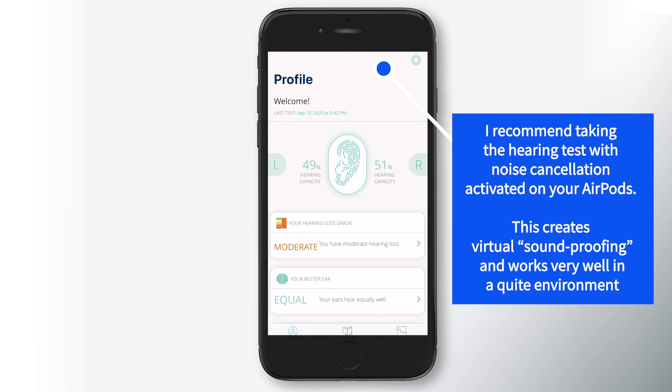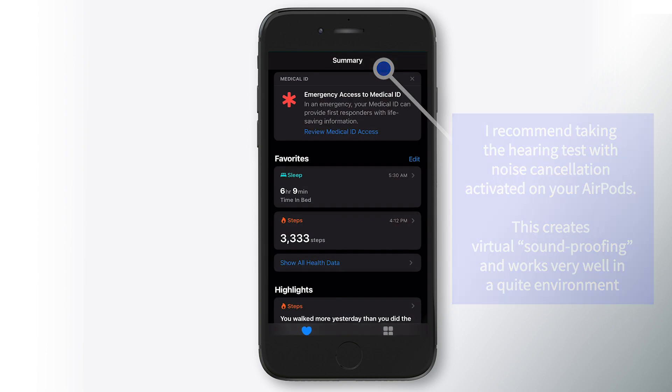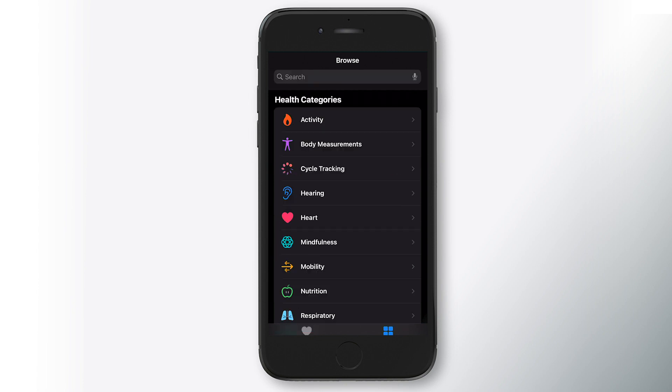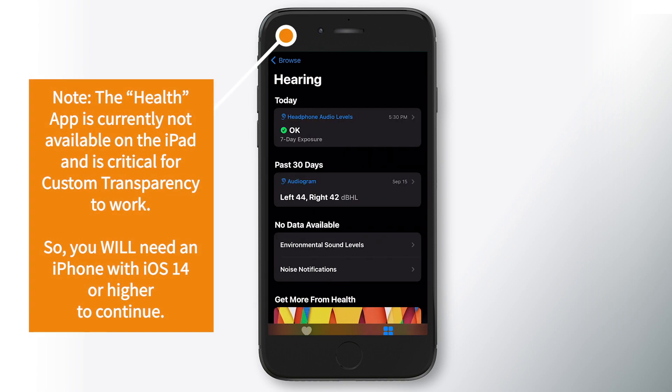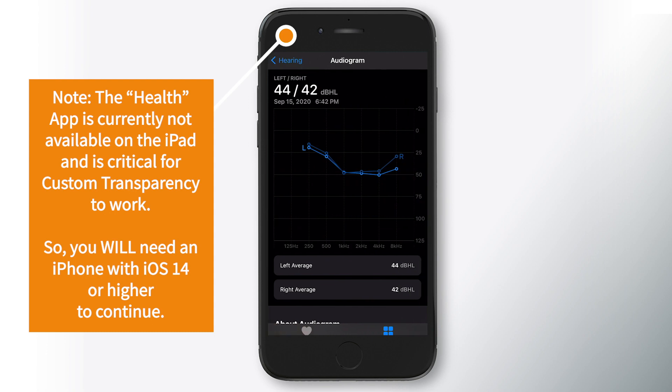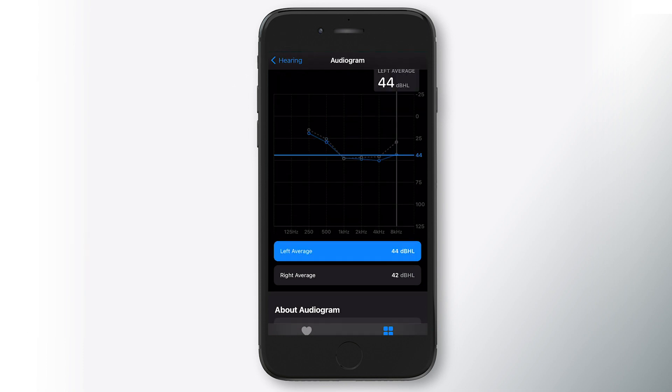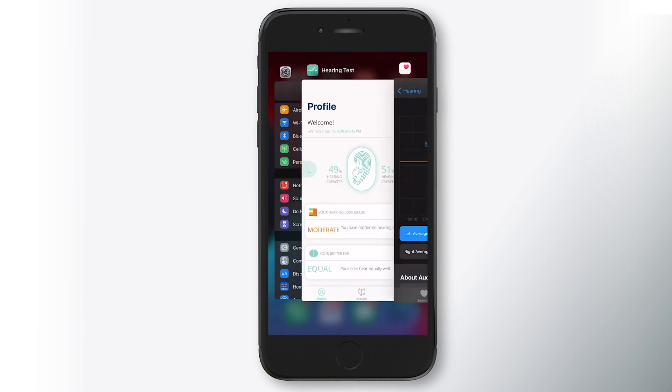Now that the hearing test is done, we're going to go over to the Health app. I go to browse and you go down to hearing. And so there you have your hearing test. Just to verify, you're actually showing your audiogram there. Meme will prompt you when you install it if you want to integrate with health. You want to select yes. So once this is in there, you've verified your audiogram is in the Health app. You can now go to settings.